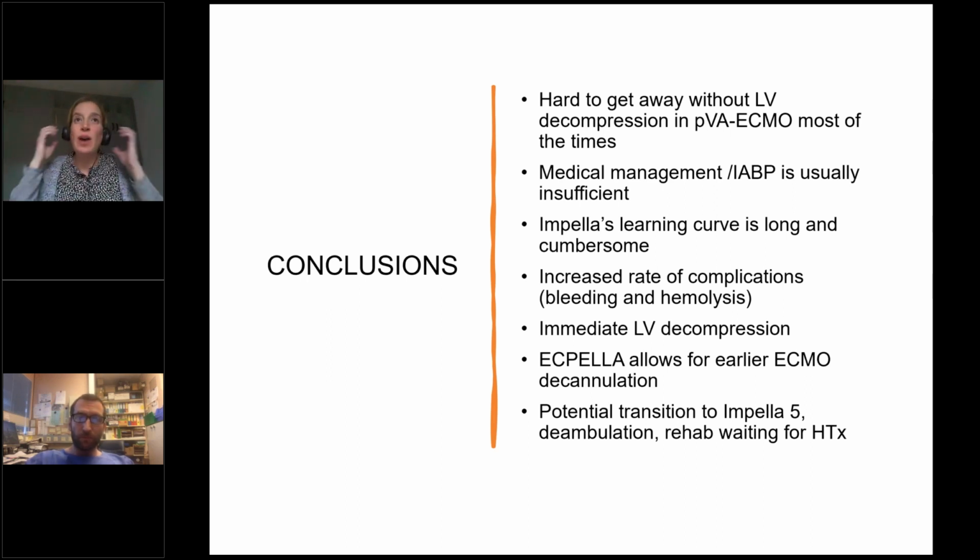So I think if you have pulmonary edema in these patients on the X-ray, but you still have ejection through the aortic valve, and you manage to start some vasodilators, reduce the afterload, even start some inotropes, and you manage to maintain AV ejection, you can treat them normally with CPAP, BiPAP, or intubation and see an offloading and see how they go. But I think if you reach the state where you have radiological findings of pulmonary edema without ejection across the aortic valve, positive pressure or non-invasive ventilation will be insufficient.